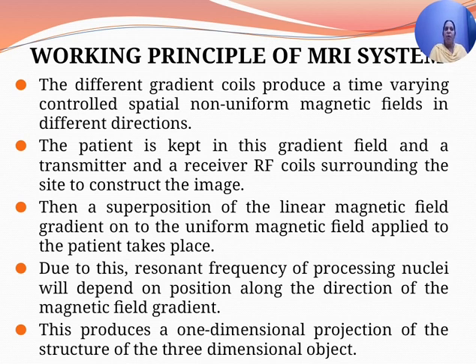The RF energy used is a form of non-ionizing radiation. RF pulses applied to the patient's body are absorbed by the tissue and converted into heat. A small amount of the energy is emitted by the body as signal used to produce an image.